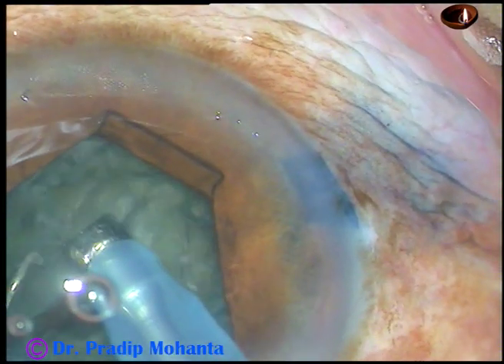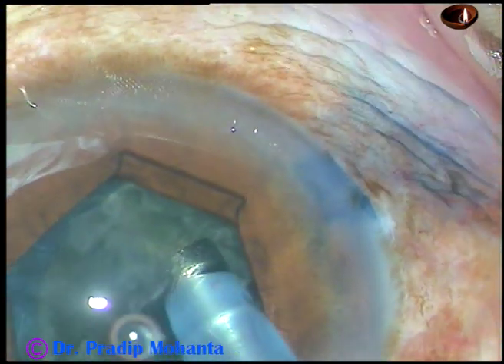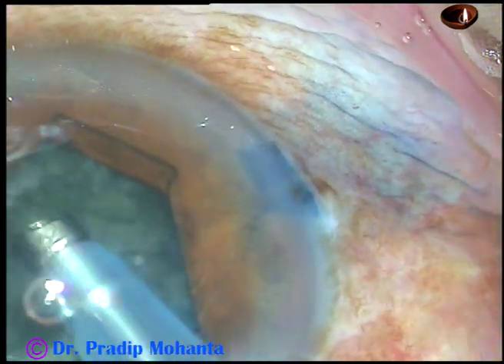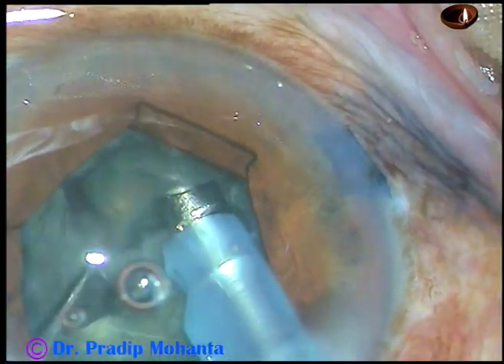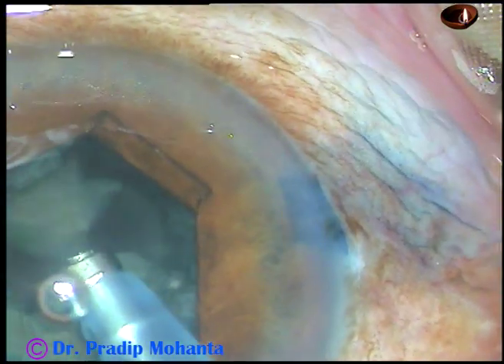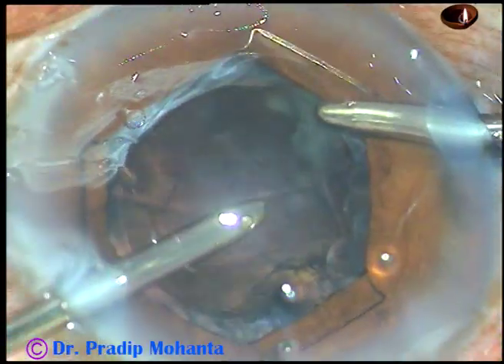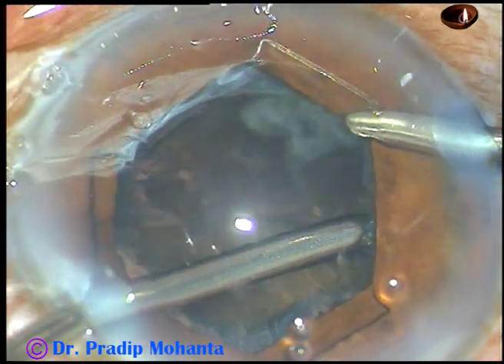Then each hemi-nucleus is divided into smaller parts, and the free nuclear fragments are emulsified and removed. The phaco power used in this case is 60%, flow rate is 45 ml per minute, and vacuum is 405 mmHg.